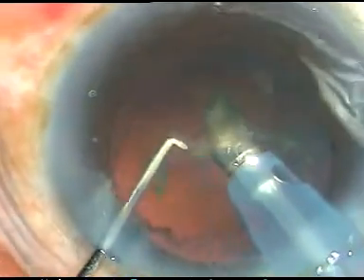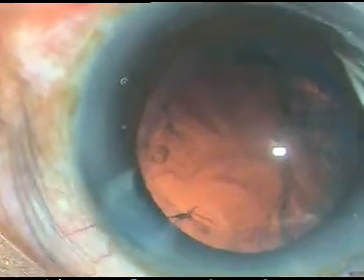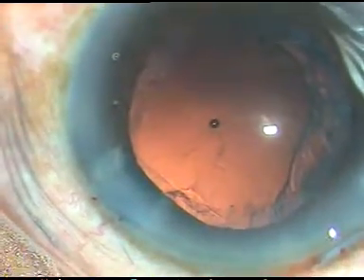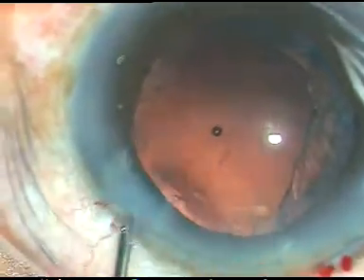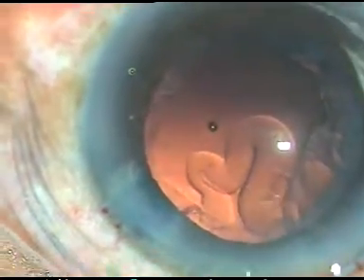That's it — I have conquered this nucleus, which is hard, with weak zonule and shallow anterior chamber. Now I can see that at the left side port, some nuclear fragment is sticking just adjacent to the inferior margin of the side port.